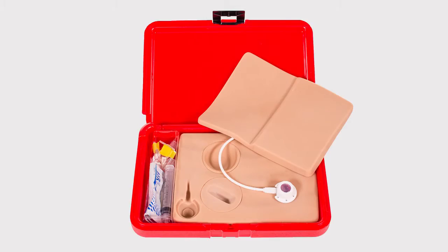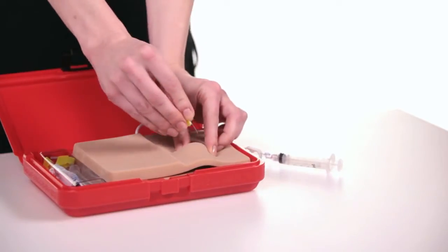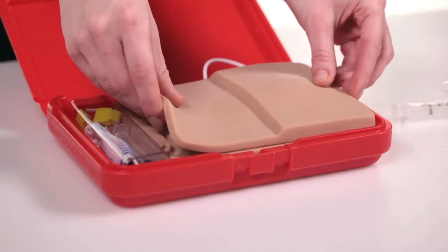When you open the model, you will notice it has a skin flap with two thicknesses. The thinner side is used to demonstrate accessing a port at a standard depth, and the thicker side a more deeply placed port.